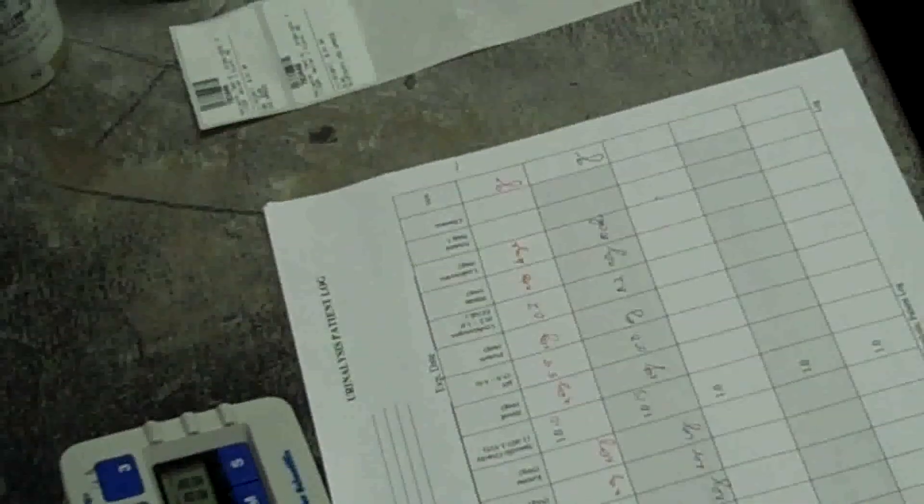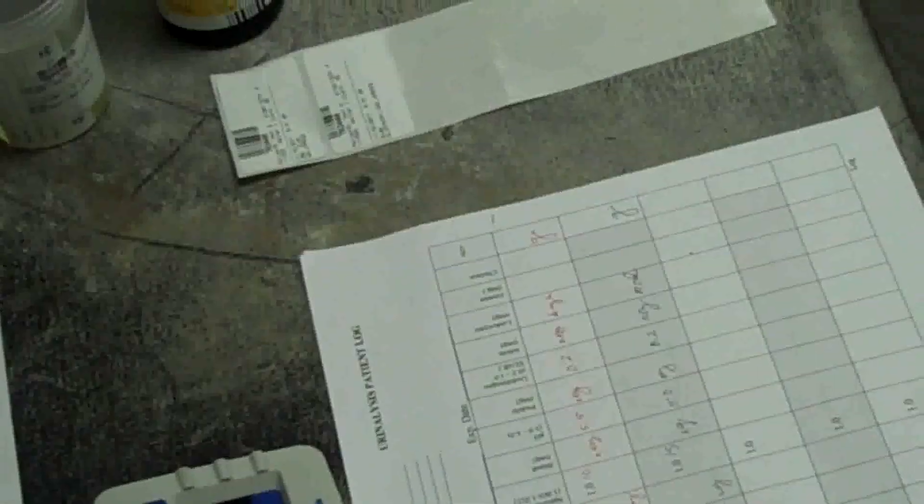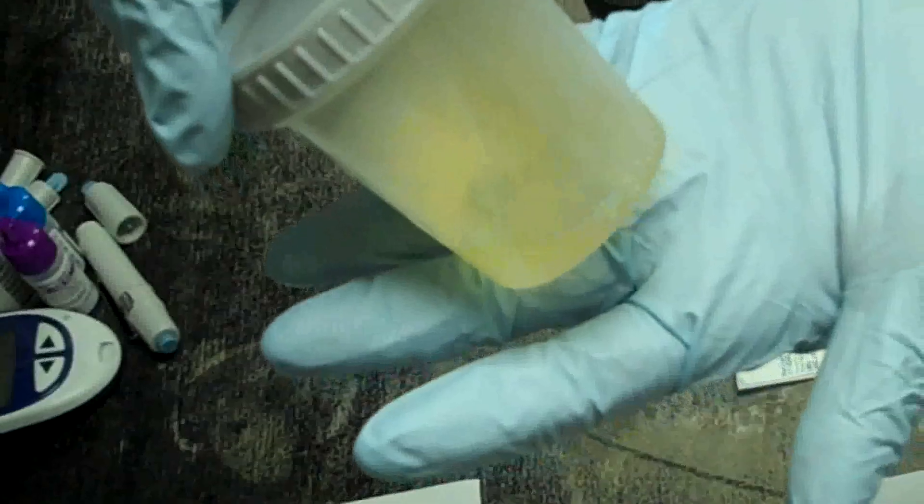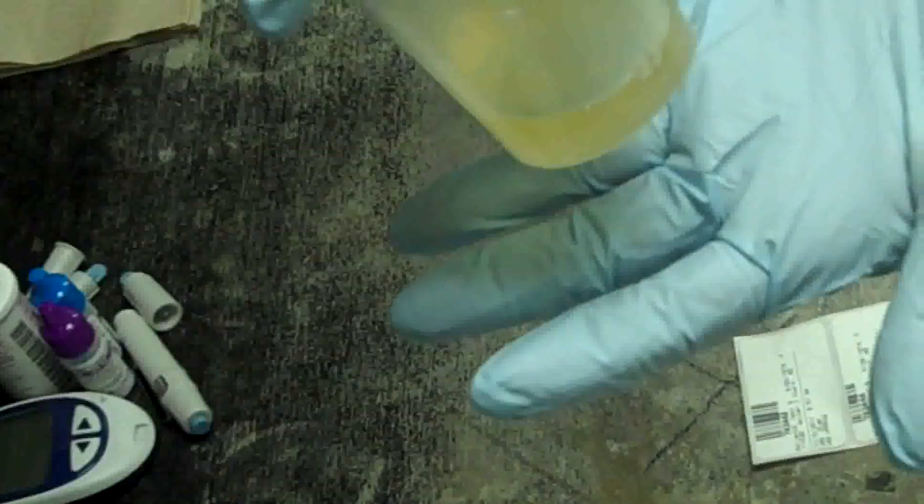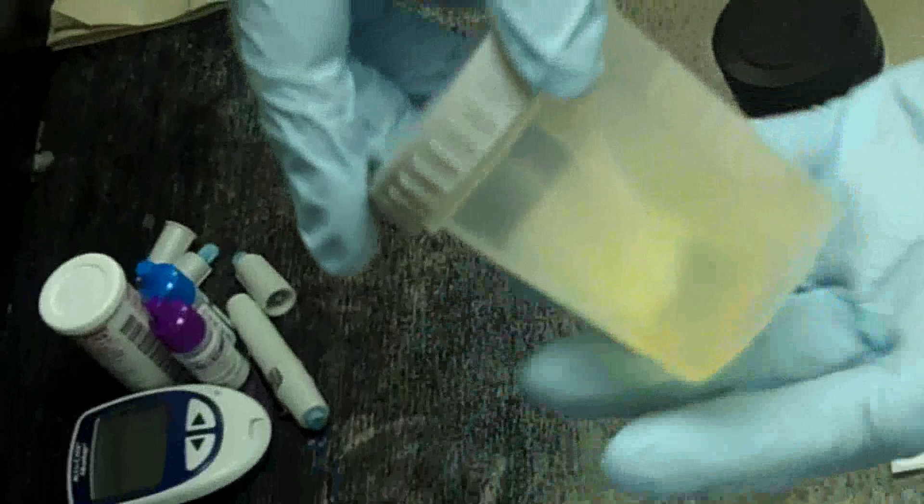Discard our dipstick. Shut off the timer. And let's record our urine color and clarity. Swirl the urine. The urine color is yellow. If we can see through the urine and read through the urine, then it's clear.